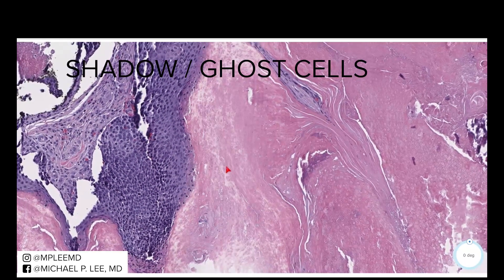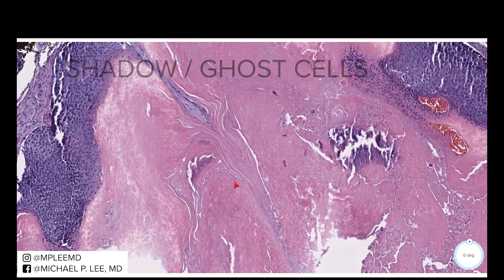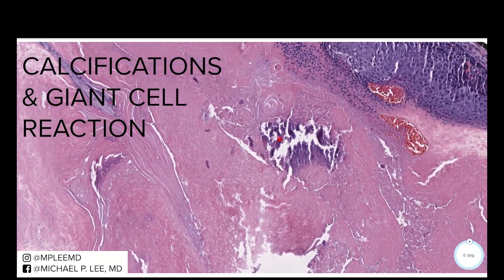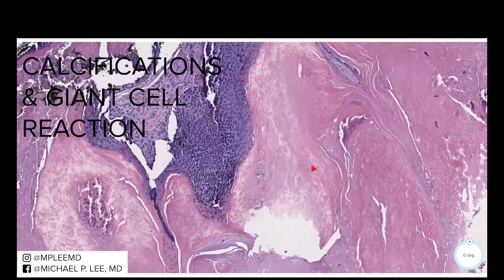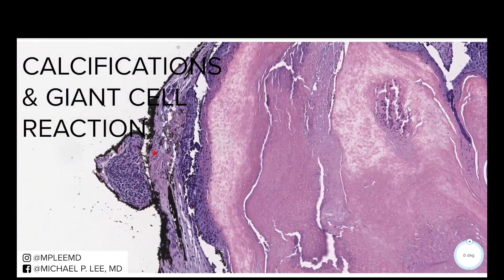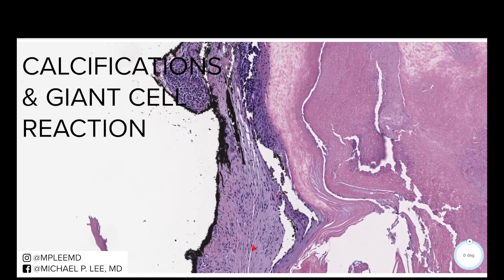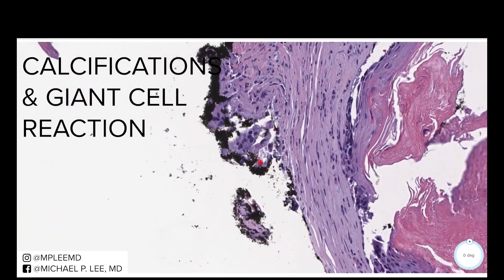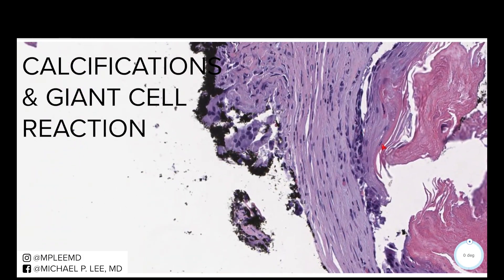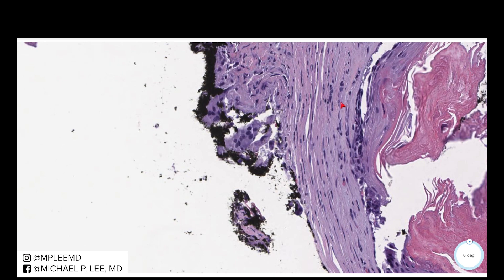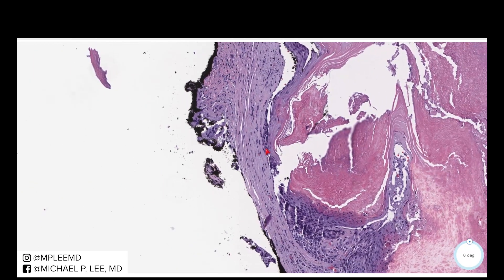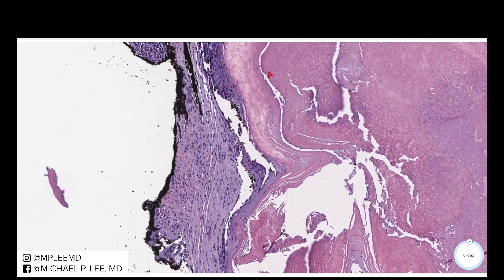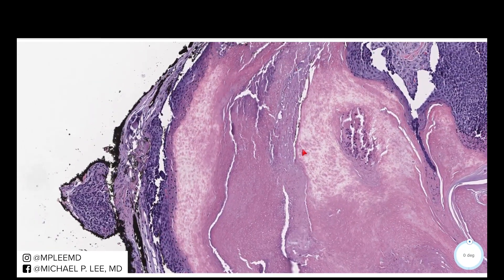One important thing to note is that you can see some calcification sometimes near the center. Also, you can frequently have a multinucleated giant cell tissue reaction, especially when this material gets out into the actual dermis. You can see that this is a well-circumscribed nodule, and these are typically present in the mid to deep dermis.